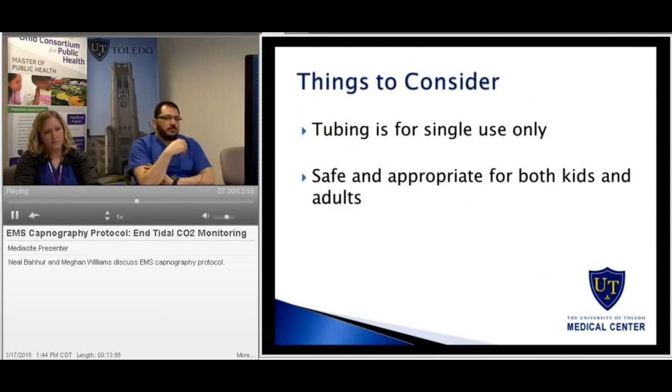Another few pointers. Please remember that the tubing used is for single use only and must be discarded afterwards, as well as capnography is safe for both adults and children and can be used with both without any difficulty. And are there any contraindications to that? There are none. Kids and adults, both safe.